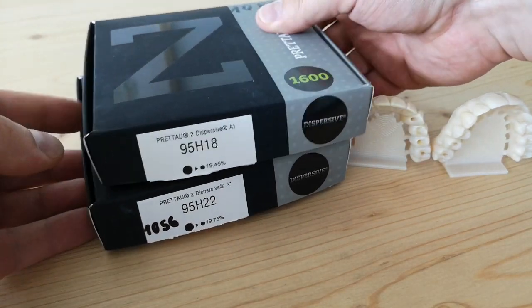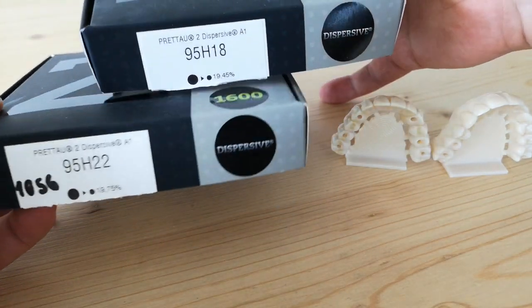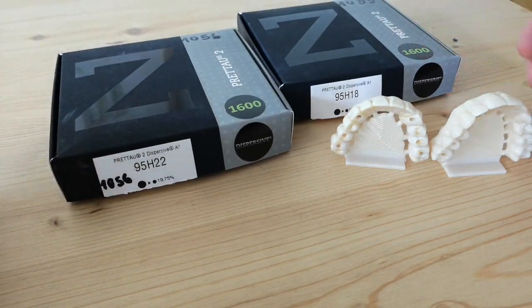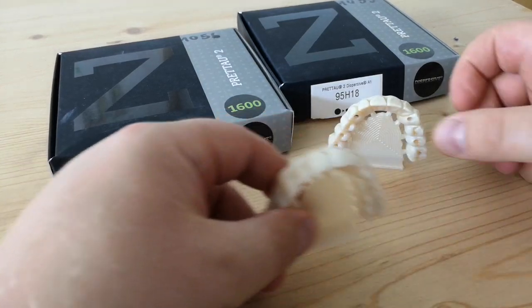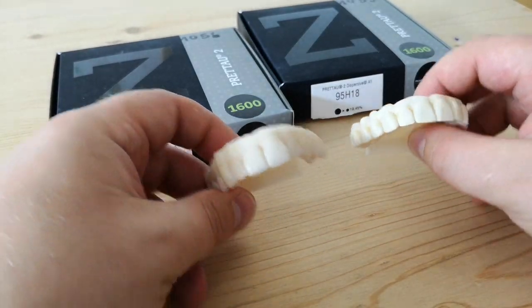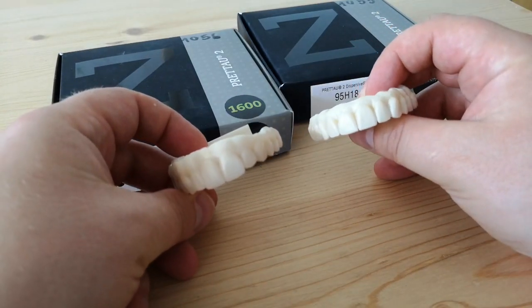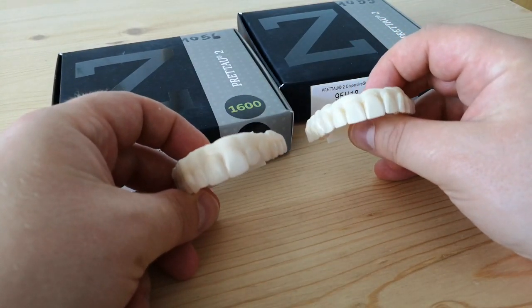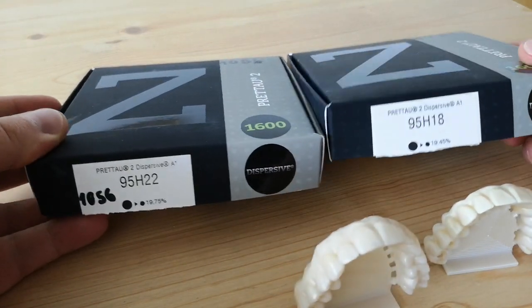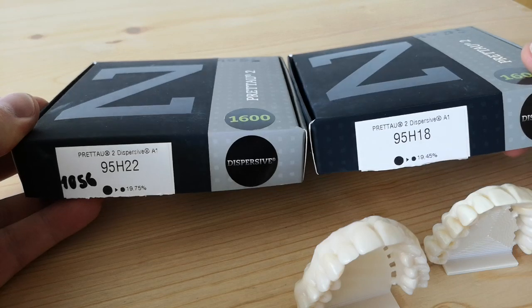We have been trying out the new Pretau 2 dispersive blanks and got some sort of issue — a pretty different result from the same blank, same color. You can see it right here: it's the same Pretau 2 dispersive A1, just a different height of the blanks.